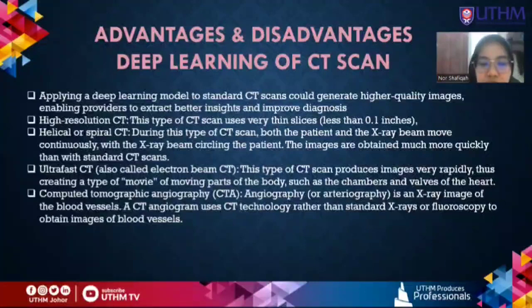This type of CT scan uses a very thin slice, less than 0.1 inch, which is effective in providing greater detail in certain conditions such as lung disease.